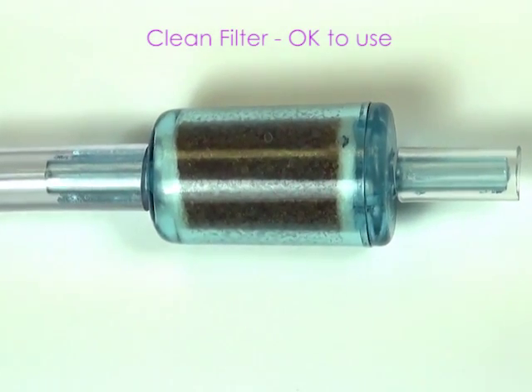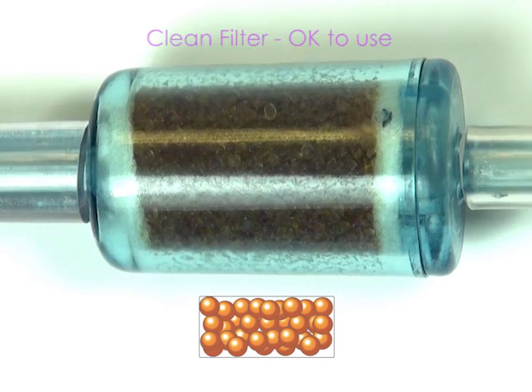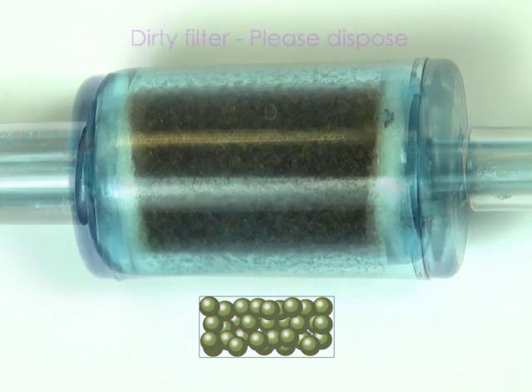The moisture removal filter will last 3 months or 150 tests. When it changes from orange to dark green, it will need replacing.